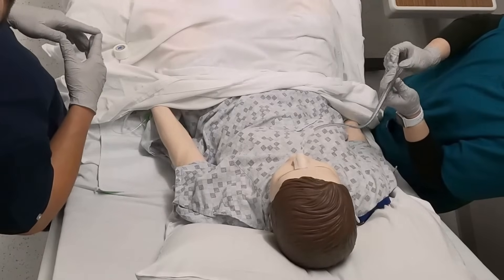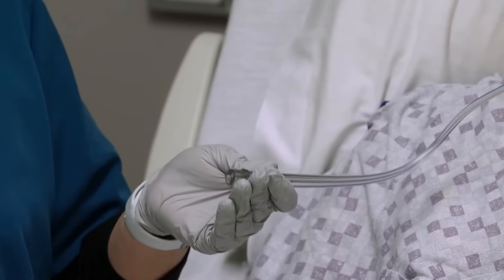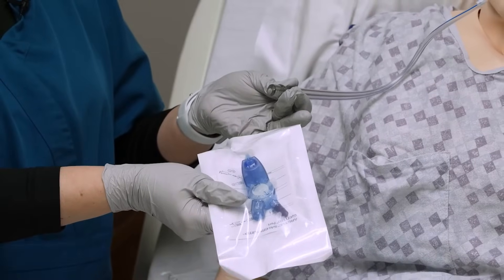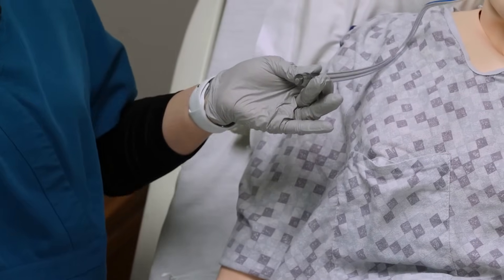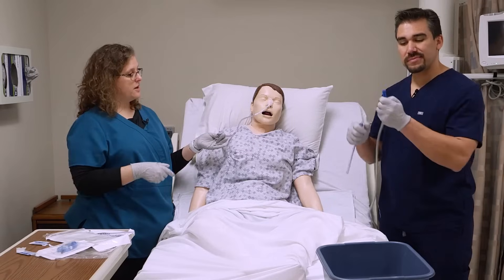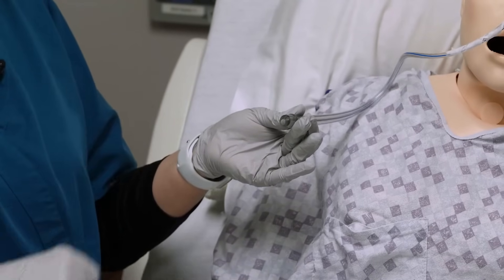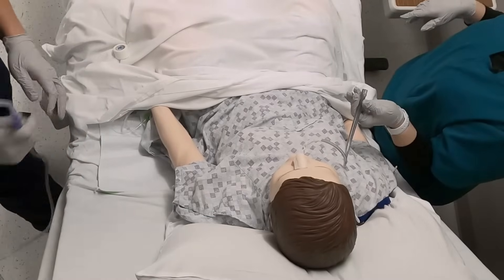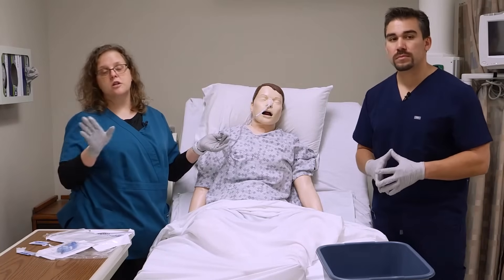Depending on where you are, you're just going to have a little anti-reflux valve to put here to keep the drainage from going all over the bed. This is a slightly fancier one that is more appropriate for using for food and fluids. And if you're just going to hook it up to suction, you'll have a suction piece that hooks nicely into your catheter so you can turn on suction. You'll need to follow whatever your orders are for intermittent suction, continuous suction, high or low, those kinds of things.